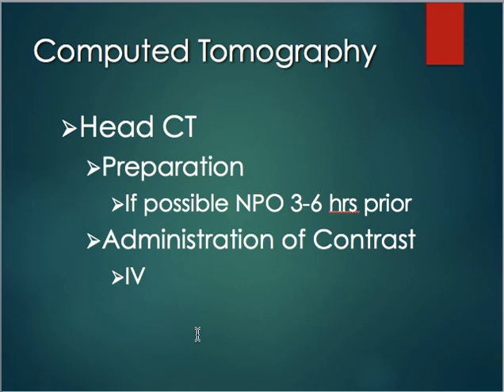Preparation for a head CT. Anytime you're given a contrast injection, you should not have anything to eat or drink at least 3 to 6 hours prior to the injection because it can cause an upset stomach. If we have food or drink in our stomach and it becomes upset, it could make us vomit a lot easier. So that's a lot of the reason why they want a possible 3 to 6 hour NPO prep, nothing per mouth, no food or drinks, before they give any contrast, especially IV contrast.